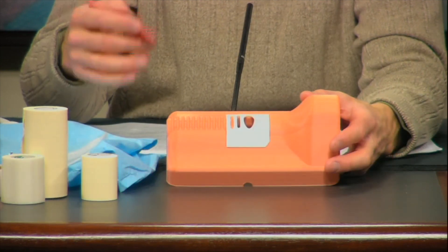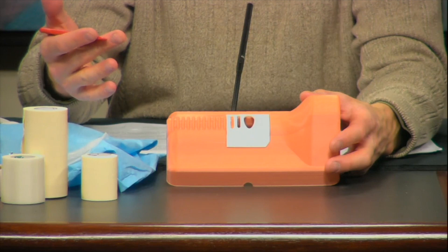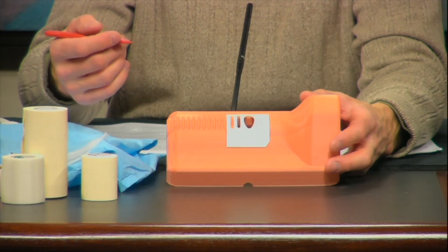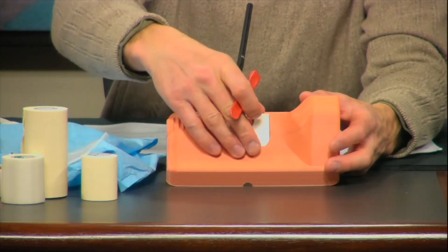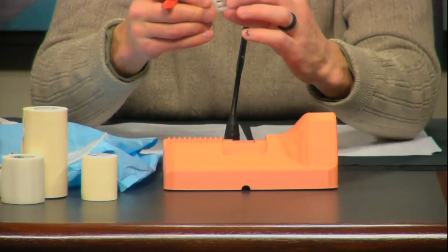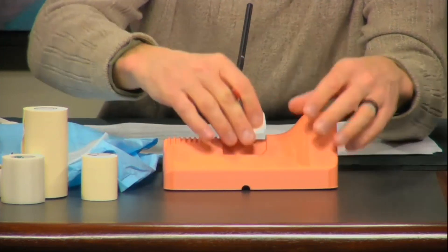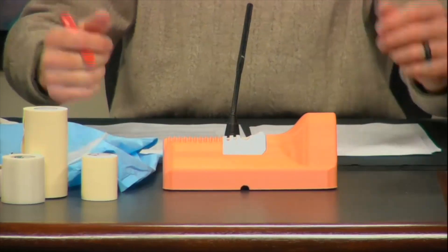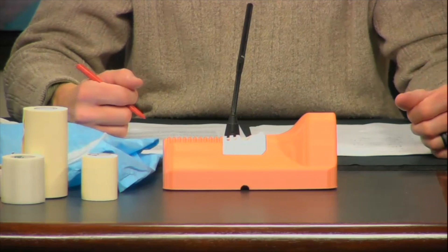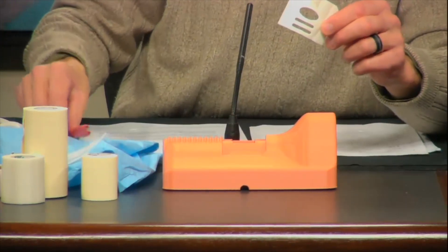Next I will demonstrate how to use this device. The first thing we're going to do is remove the cartilage overlay unit from the neck unit.